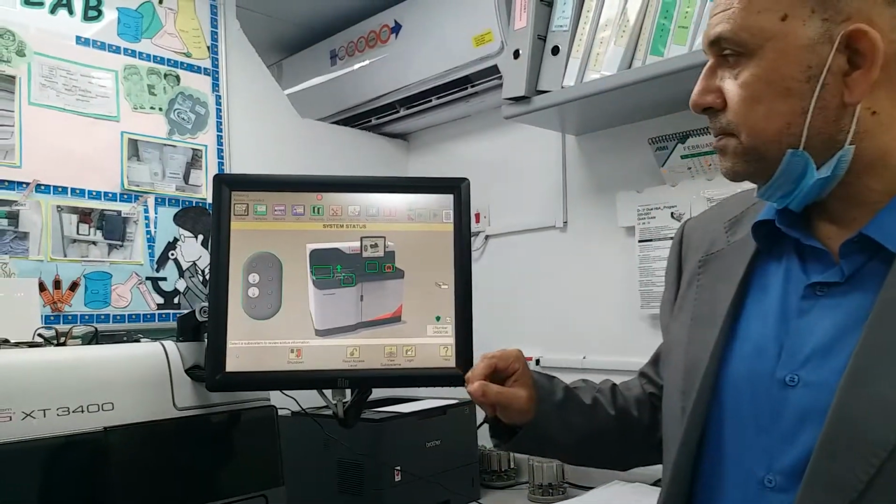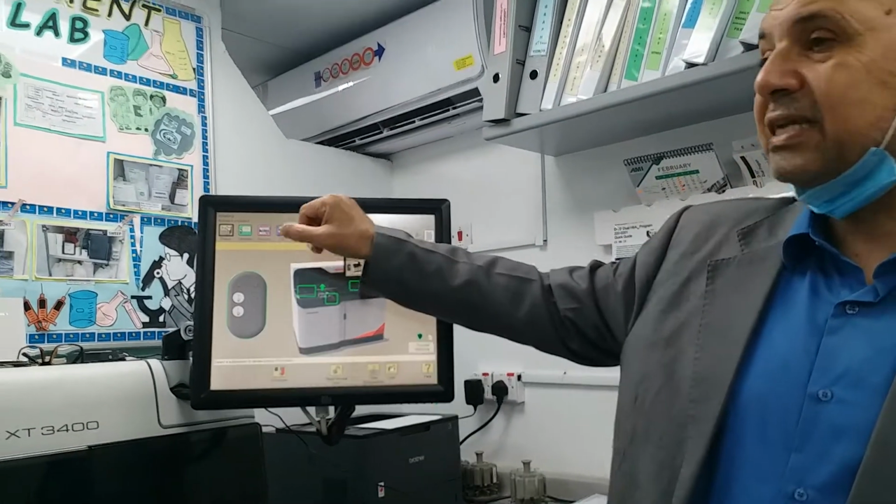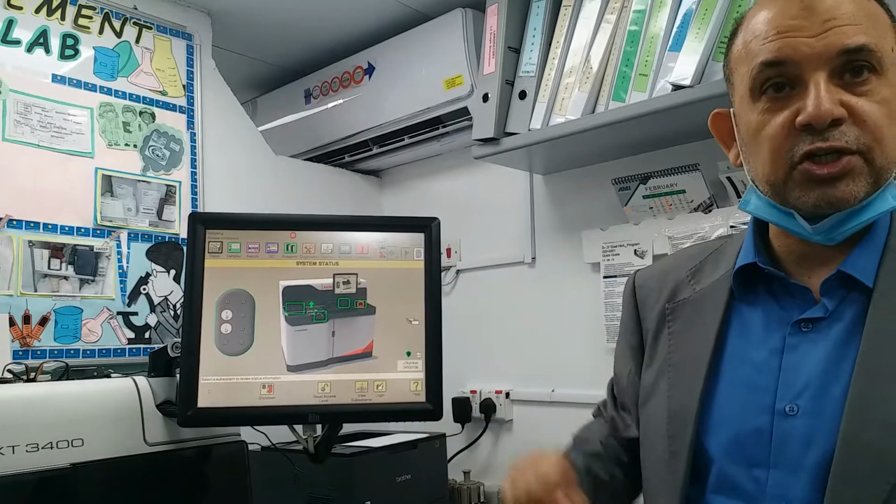Now, after changing the ADD, the machine should automatically reinitialize or initialize the system to set all the things according to the requirements of the instruction.